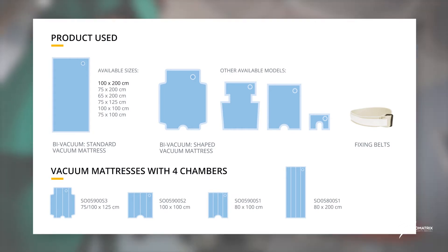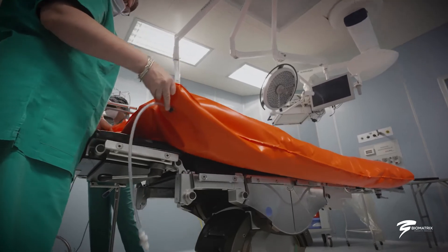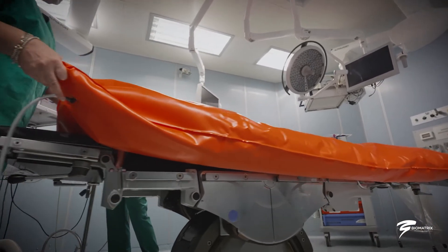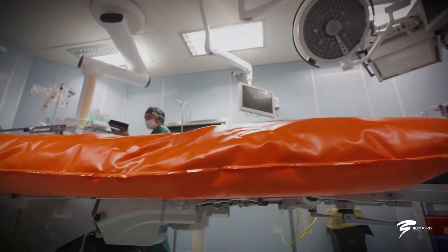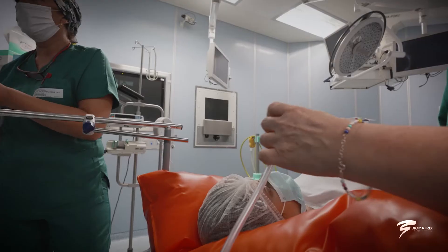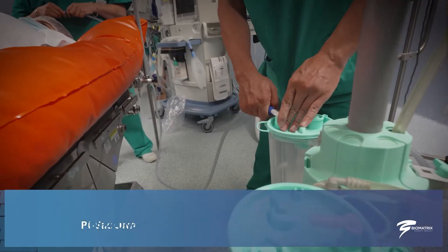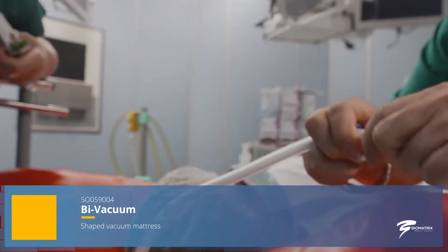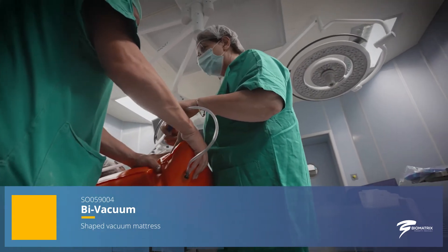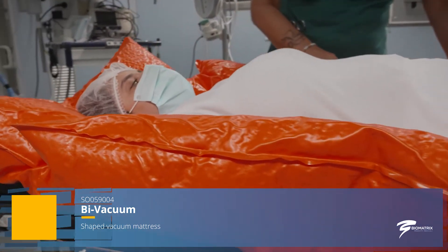The vacuum is a vacuum mattress used to position the patient on the operating table. It is placed directly on the operating table and connected to a conventional aspirator. As the air is sucked in, the vacuum gradually stiffens and can be shaped to better obtain the desired position. It is ideal for long-lasting operations and for interventions that require exposing particular anatomical areas.